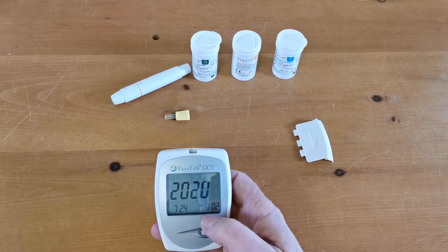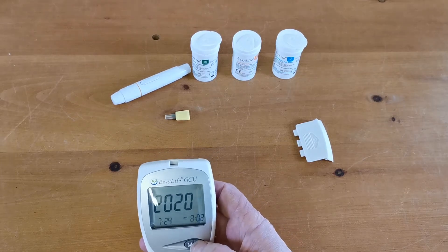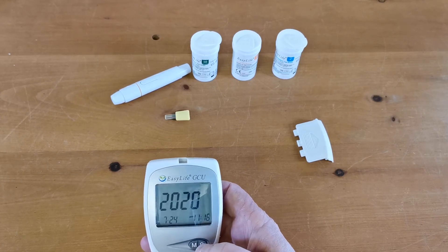Press again and we go through to the hour. It's a 12 hour clock — this is AM — so we're going to set it to 16 minutes past 11.